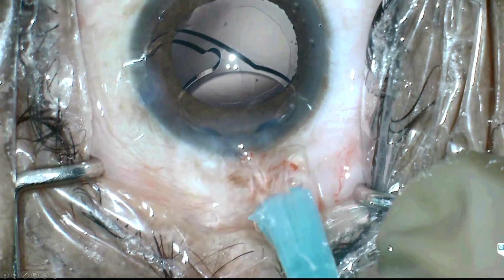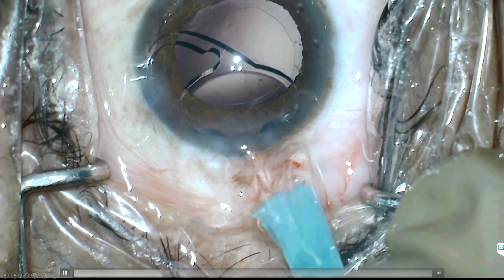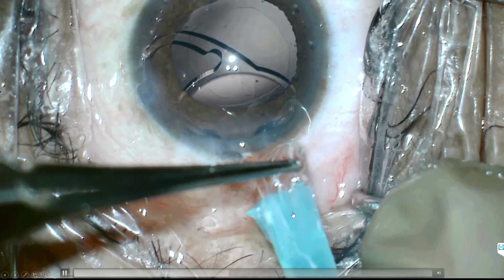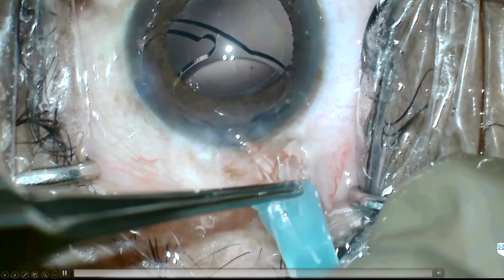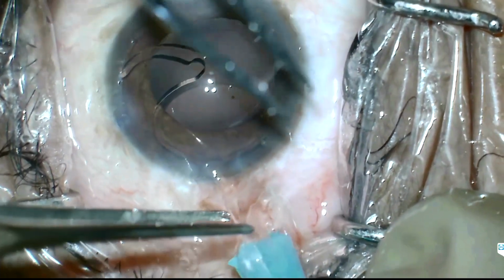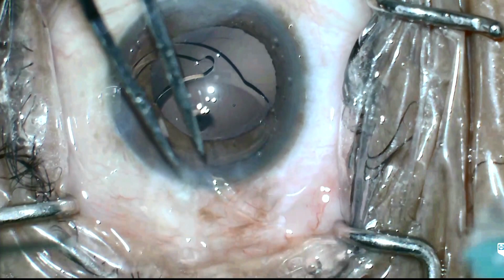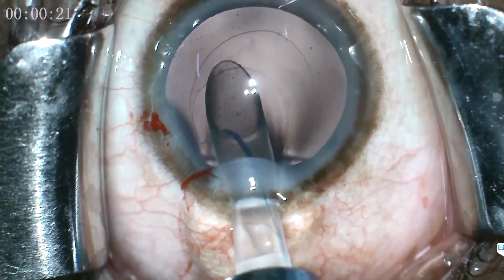The same thing can happen with the silicon tip also. Here, when it happens with a silicon tip, you cannot pull. Even if you pull, it will get snapped off. So you have to cut the cartridge with a blade at the side port so that it expands and gives a space, and open it up. If you have a good assistant, ask them to pull the trapped trailing haptic. If you just pull the trailing haptic, it will get snapped off, and we have to do everything again. This is a 3-piece IOL implantation, so here you cannot do incision assisted.